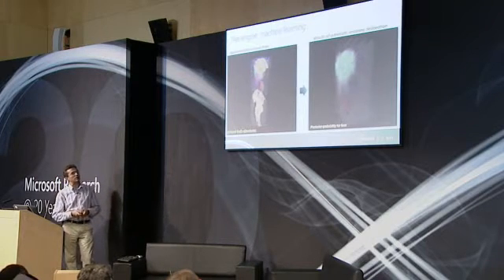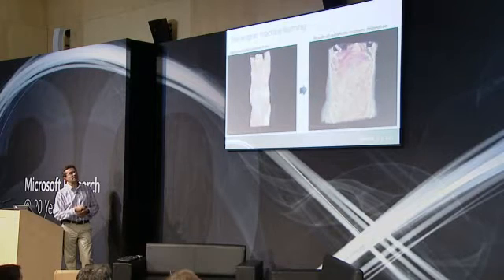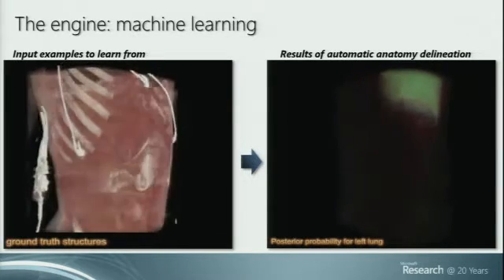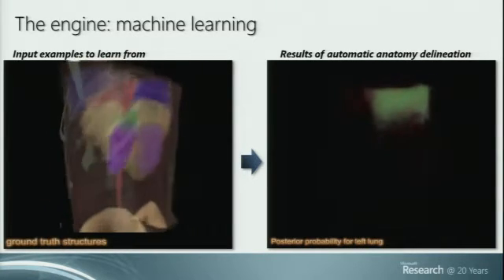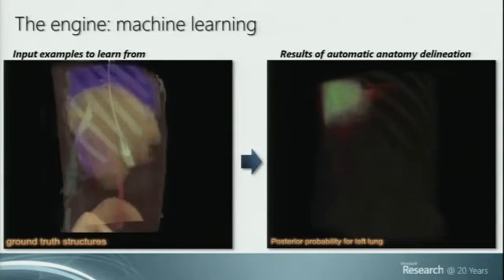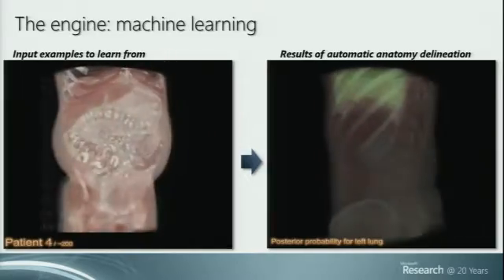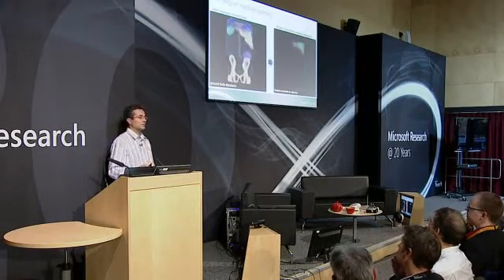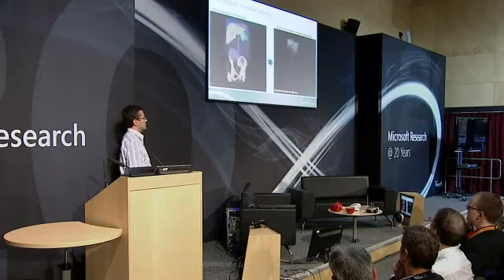It scales up very well with data, and we can then, on a previously unseen patient, infer where all the different organs are. So in this case, you see the green area here indicates the left lung, which has been cropped by the image about halfway, but we can still figure out where it is. Earlier you saw the green probability mass for the liver, and you can do this in turn for all the organs that interest you. Once you have this information, then you can straight away automatically raise some alarm, say, oh, the heart in this patient is particularly large. The tissue density of the liver is higher than it should be, or in the kidneys. So perhaps that's an indication of calcification or other types of lesion, which a doctor might miss, especially if they're very small.